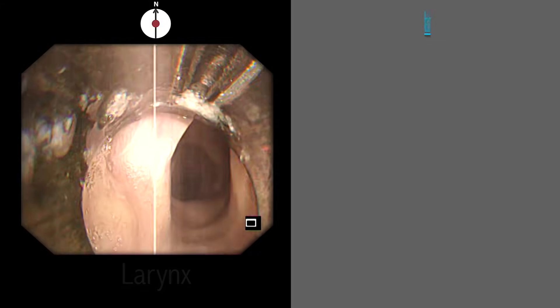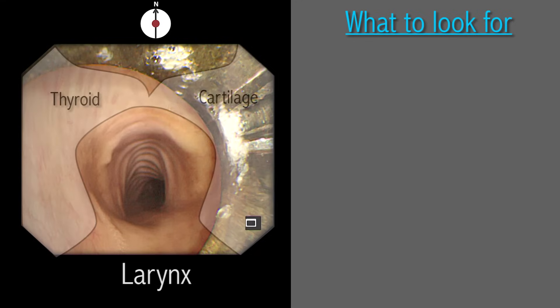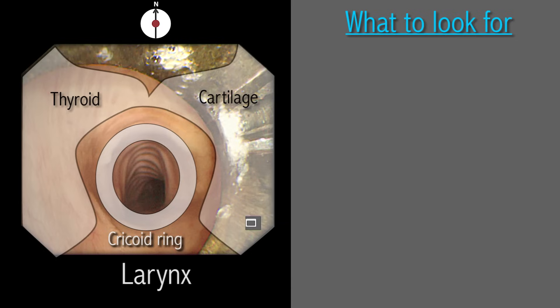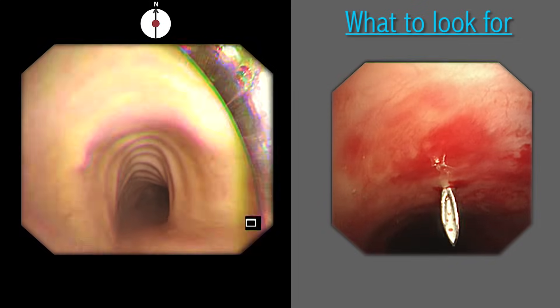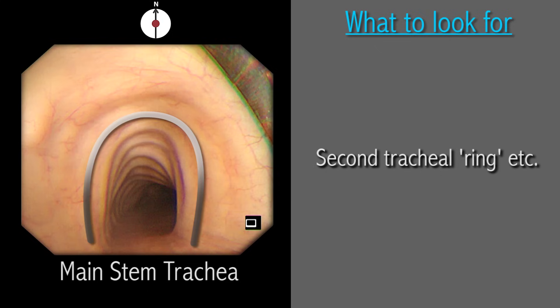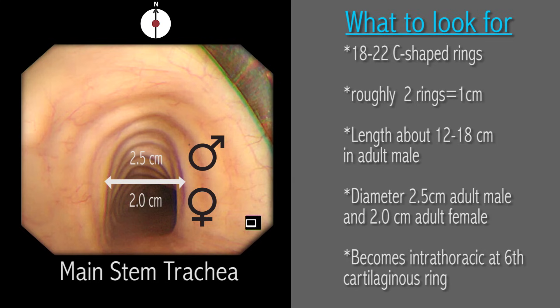Once the vocal cords are passed, we enter the larynx. This airbox is kept open at all times by a number of cartilages and membranes. We will only see the mucosal covering of these structures from the inside, but landmarks of the thyroid and cricoid cartilages are noted. The cricoid cartilage is the only complete ring, and the cricothyroid membrane is the landmark for introducing a mini-trach or injecting local anesthetic. The true trachea starts distal to the cricoid cartilage. The C-shaped tracheal rings are noted to dent the mucosa — in adults there are 18 to 22 rings, roughly two rings per centimeter. The trachea is 12–18 cm long in the adult male and shorter in the female. The adult male trachea has a diameter of 2.5 cm and the female 2 cm — a useful guide when considering tracheal stent size.